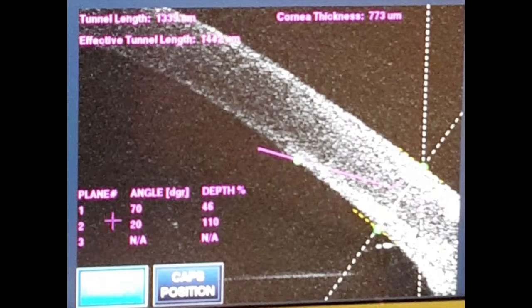And this is a still photo of that OCT image, and this is an annotation of that image. The red arrows are indicating the area of arcus senilis. And again, there's a circular area of clear cornea here, indicating that the start of the incision is not posterior enough. So again, I'll need to go back to the main screen and drag the corneal incision more posteriorly.